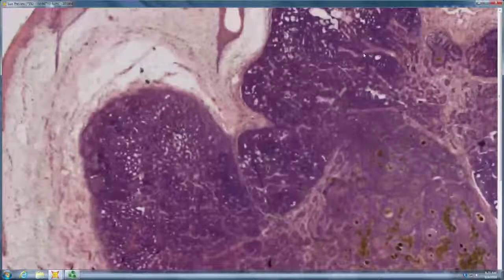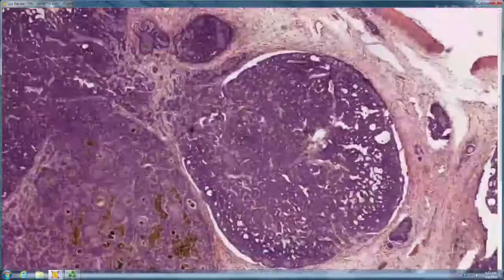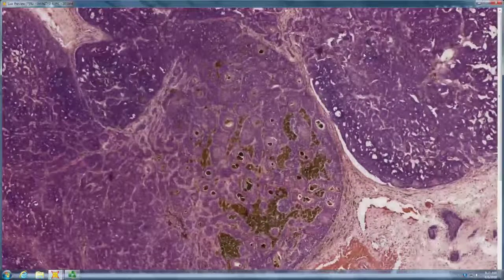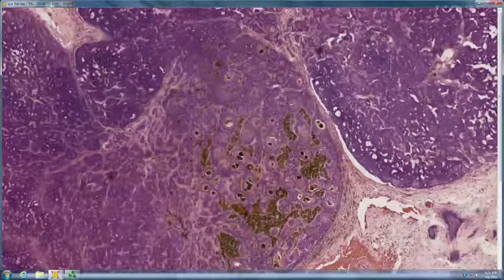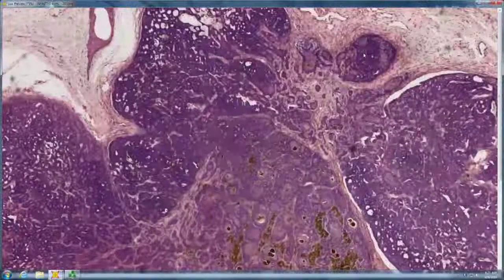Like basaloid islands with clear space. I'd say like sebaceous. So, I see the concentric. Did you see like a trichoepithelioma? So you see concentric fibrosis, and it's pigmented, which sebaceous rarely is, but pilar things commonly are. So probably a big trichoblastoma or trichoep because it's superficial.